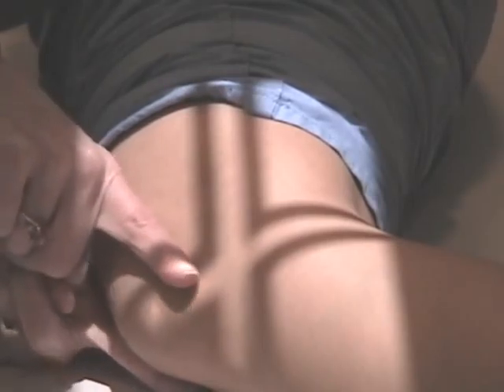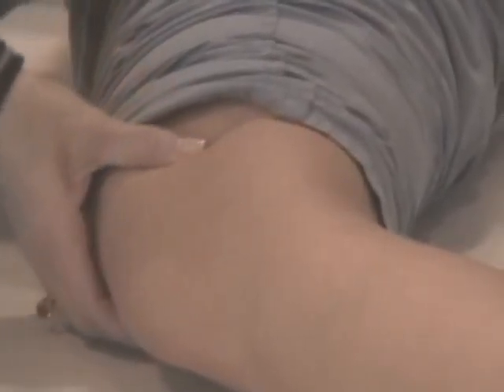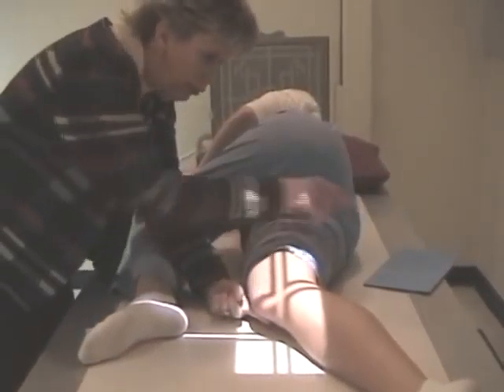And now I need to get her into a lateral position. I've centered the knee joint, but we're going to get her lateral. And what you do is you palpate gently. You're just feeling the edges of the patella, and you want the patella superimposed, the edges one right on top of the other. How you manipulate that is I want you to rotate the patient's hips. Watch how I'm moving the hip and what it does to the leg. Okay? I don't want you reefing or pulling on a patient that's hurt at the knee. The hip will do that. So you rotate that hip until the knee is into a lateral position.